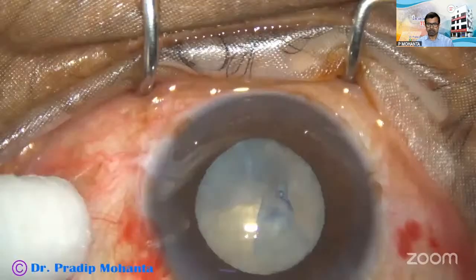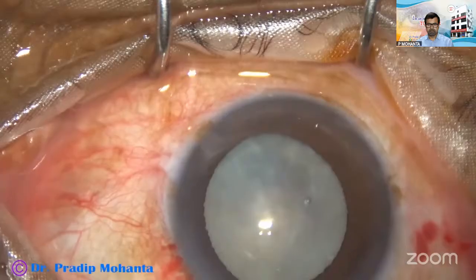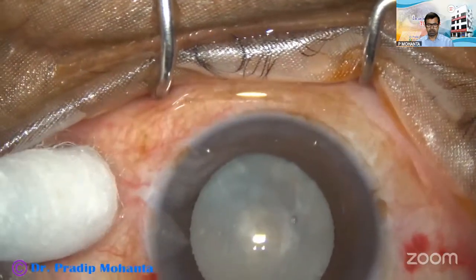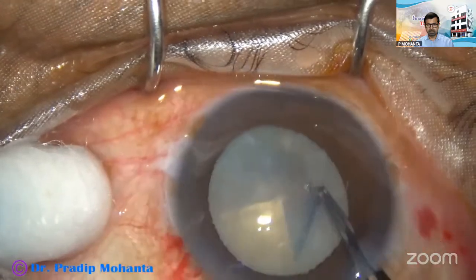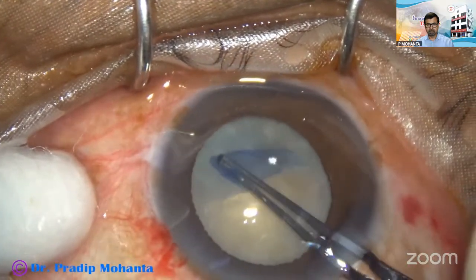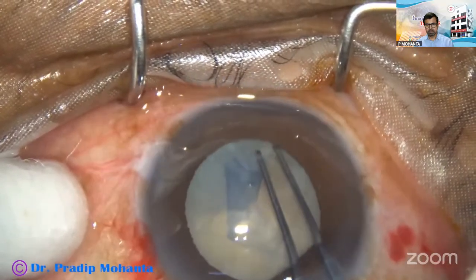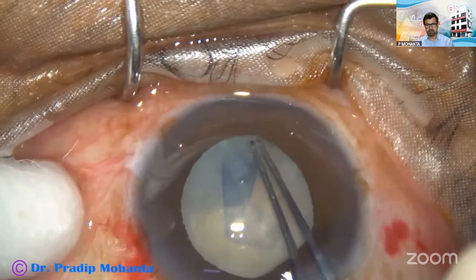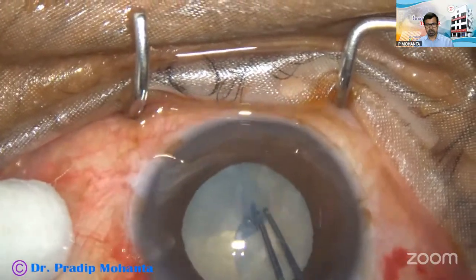This is another case. In this case, there is fibrosis of the anterior capsule inferiorly. So as I try to do the rhexis, it goes nicely, but at around 6 o'clock or 6:30, there is a fibrous band and the rhexis goes to the far periphery.